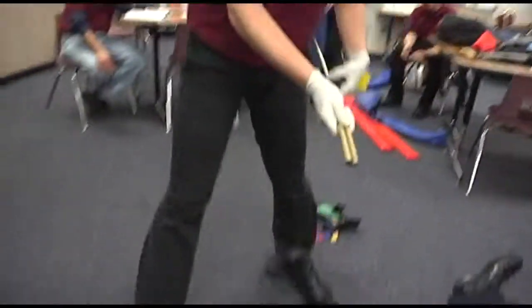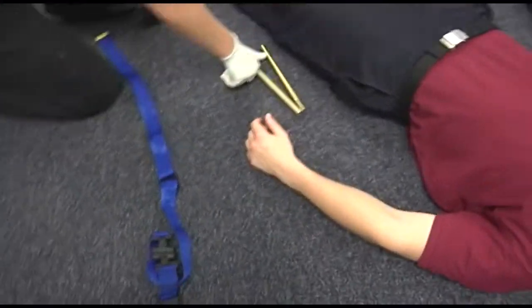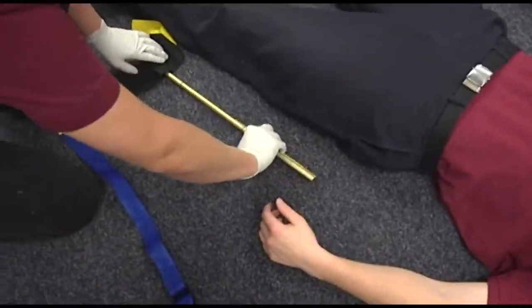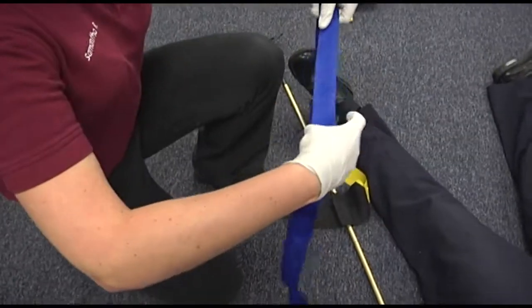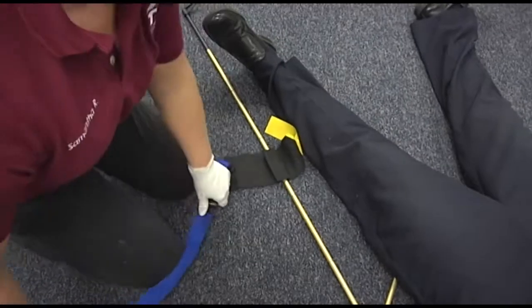That should be able to lay on the floor and stay closed. Otherwise, you can just close it one more down when you apply it. Applies the distal security device, the ankle hitch.